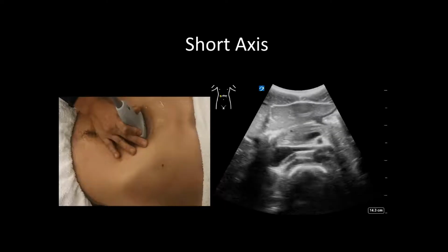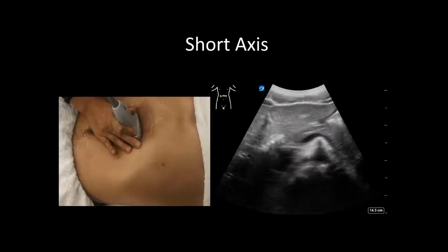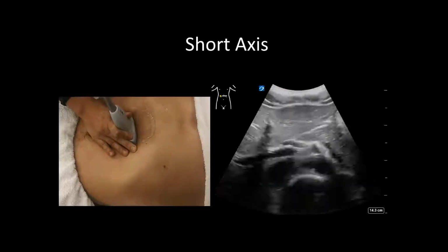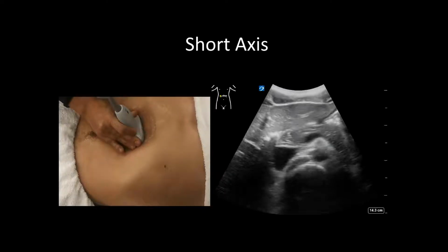It's not uncommon when performing this sweep that you may come across bowel gas obstructing your view. Graded compression, meaning slight downward pressure, to displace this bowel gas may assist in obtaining these views.